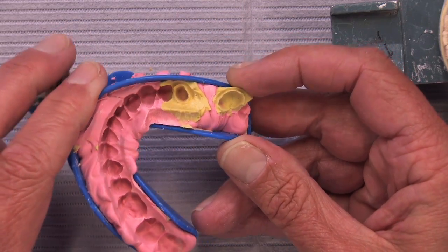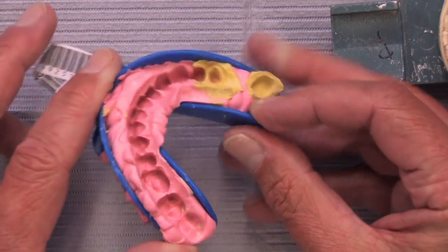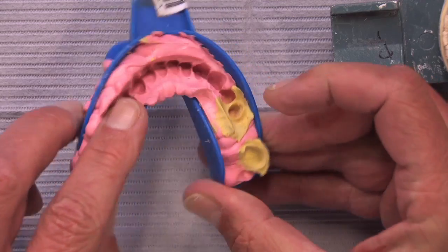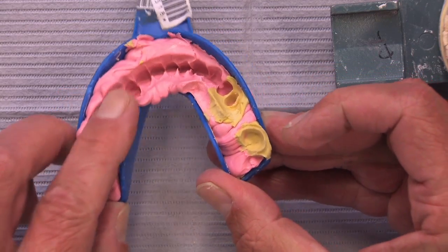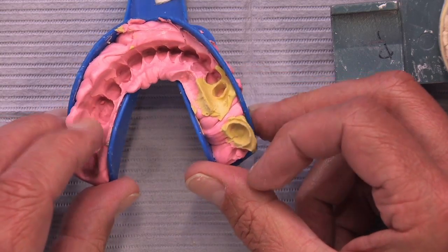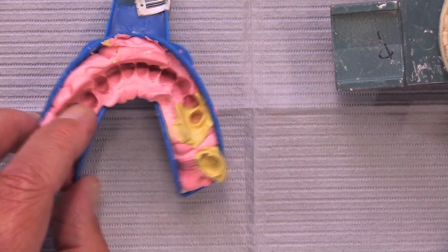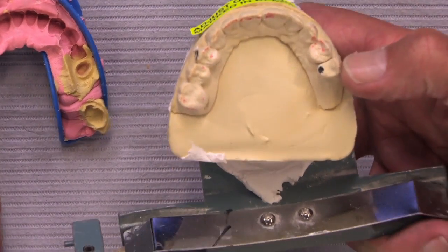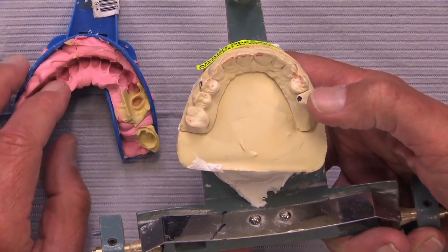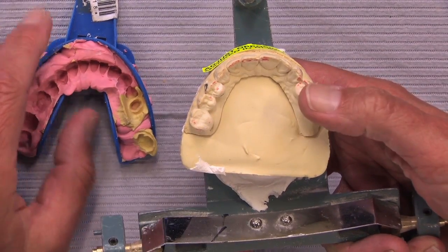And I know the dentist can do a little bit better. I don't know if they were rushed, but you can see the void right along here as well. Over here, it actually turned out pretty good. We've got a nice impression around the buccolingual and occlusal surfaces of all those teeth. So with another chance to go in there and do that, hopefully we'll be able to capture this well. The dentist could even go ahead and adjust that opposing tooth before the impression is taken, so we could deal with that now in the laboratory and not have to do that when the bridge is actually seated.